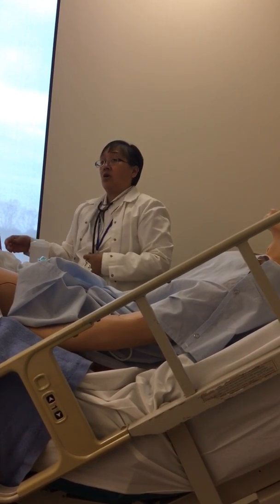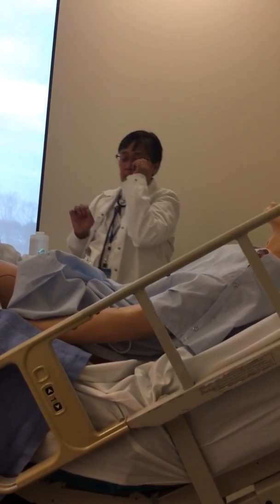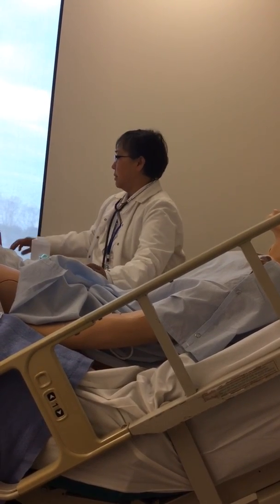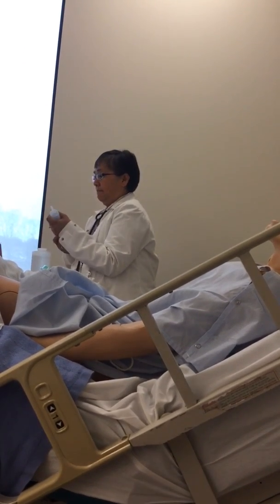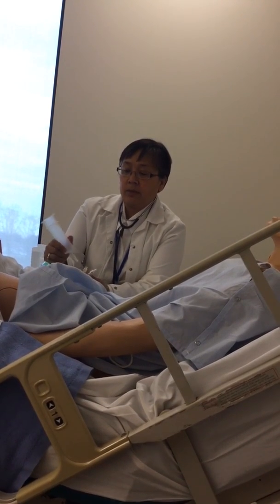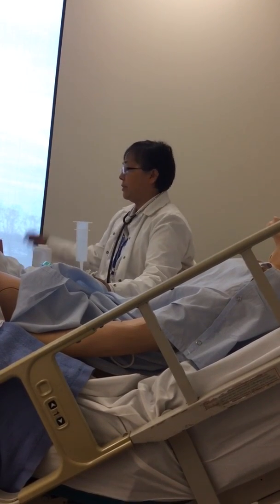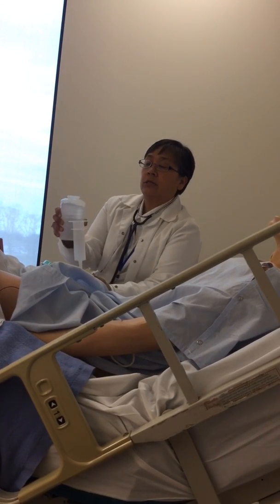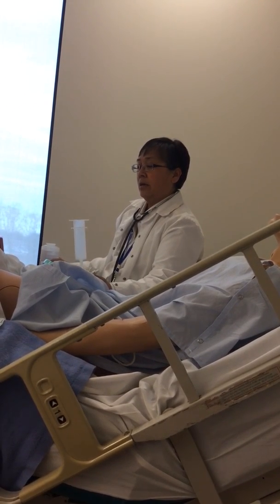So I have all my medications all mixed, and when I mix them all up, they'll be in little medication cups, and I'm going to now give my medications. And I've got gloves on too, by the way. I'll put my syringe on like so, hold it steady, give my first medication, pour it, follow it up with 15 cc's of saline, tap water, let that go down.